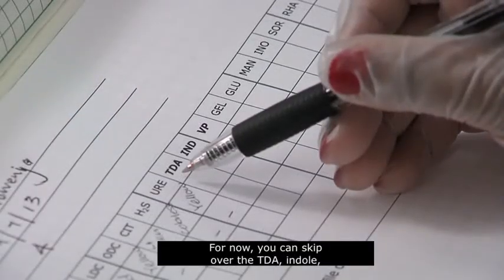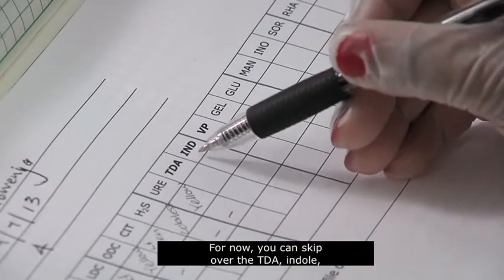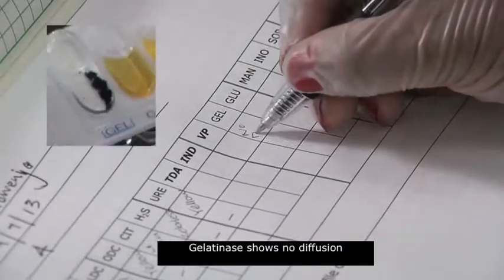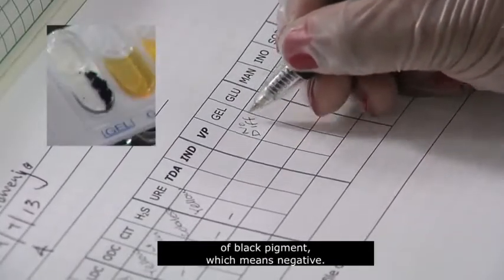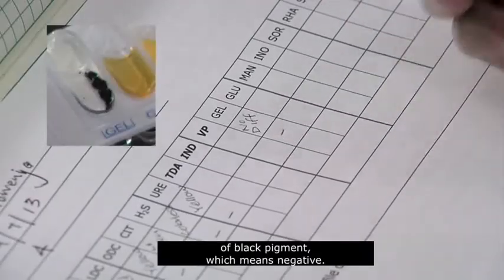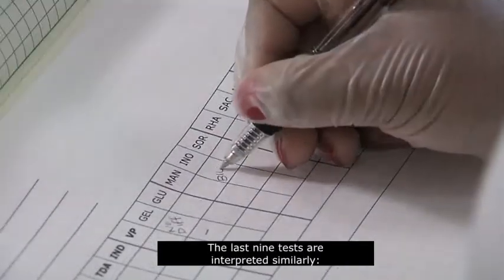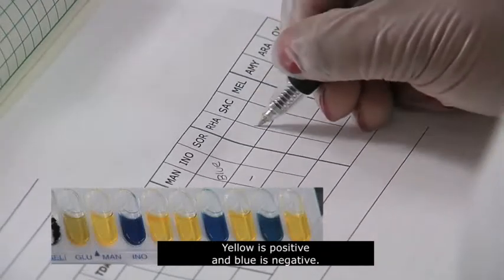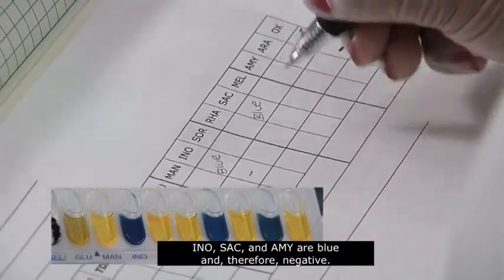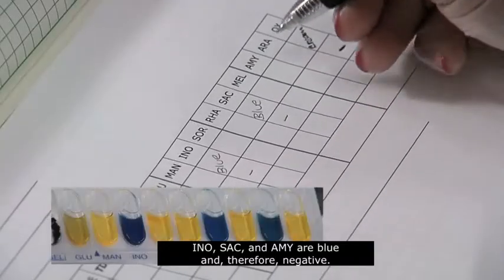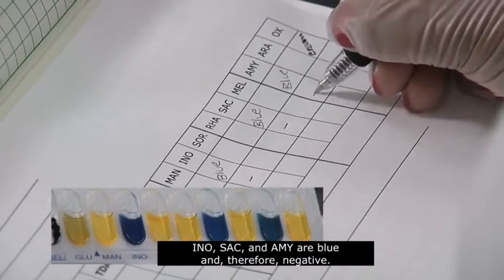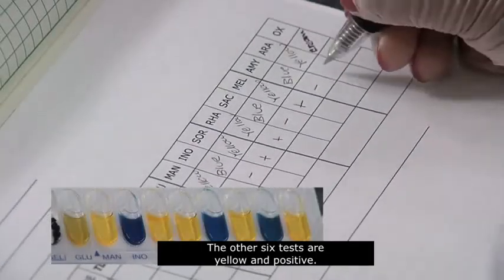For now, you can skip over the TDA, Indole, and Vogue-Proskauer tests. Gelatinase shows no diffusion of black pigment, which means negative. The last nine tests are interpreted similarly. Yellow is positive, and blue is negative. INO, SAC, and AMY are blue and, therefore, negative. The other six tests are yellow and positive.